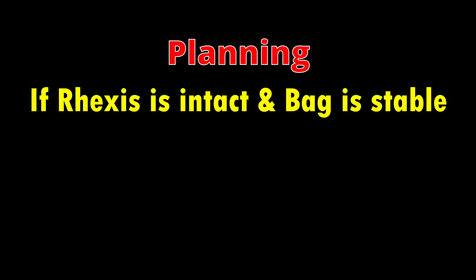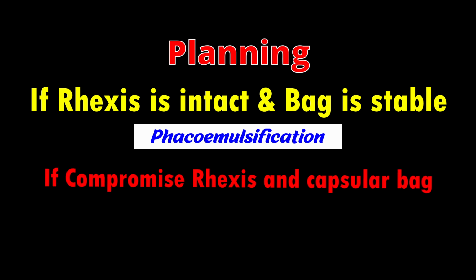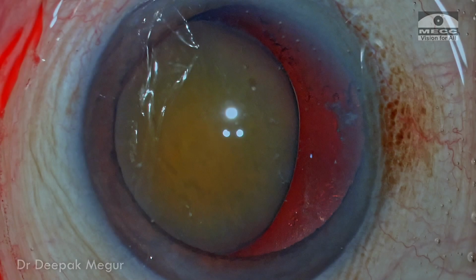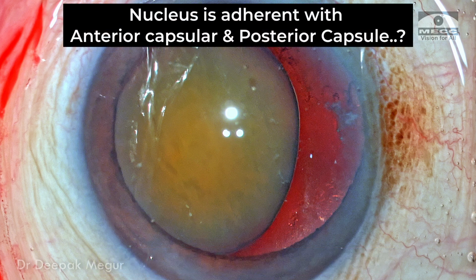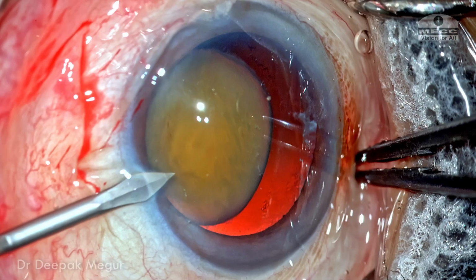If the rhexis is intact and the bag is reasonably strong enough, then I'm going to do phacoemulsification. If the bag is severely compromised and I'm unable to save it, then my plan is to extract the nucleus manually and then probably think of putting an iris clip lens. Another concern for me is that the nucleus has got stuck in this particular position, so it is not mobile. Maybe it has got adherent to the anterior capsule and the posterior capsule, and I don't know how easy it is for me to dissect this nucleus out from the capsular fornix.